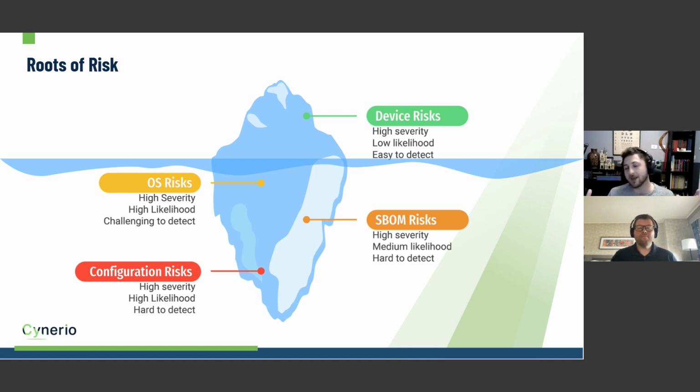But ultimately, if it has a web page that is open with no authentication, and an attacker can just access that web page and control the CT device, that's what the attacker is going to do, right? It's the path of least resistance. It's the easiest. It's also surprisingly tricky to detect if you're a hospital and you're interested in closing this open web page, for example. We go into a couple of other examples of how this manifests in the real world later, I think.